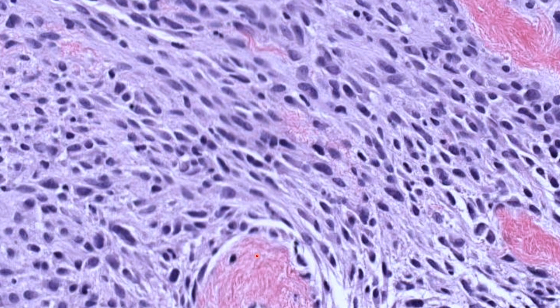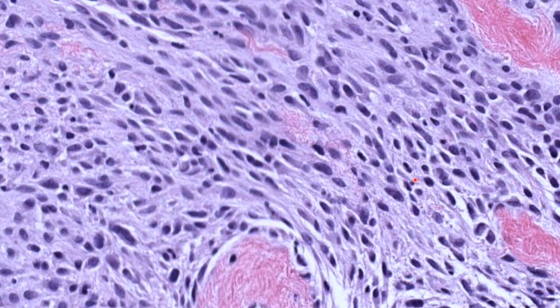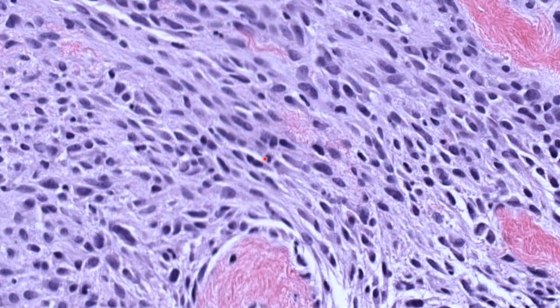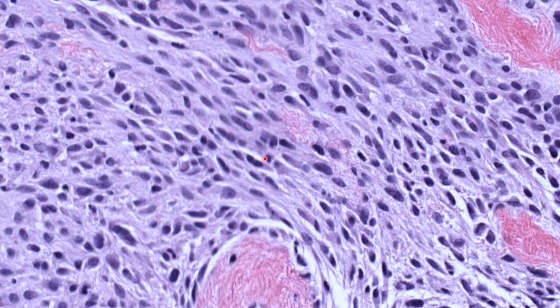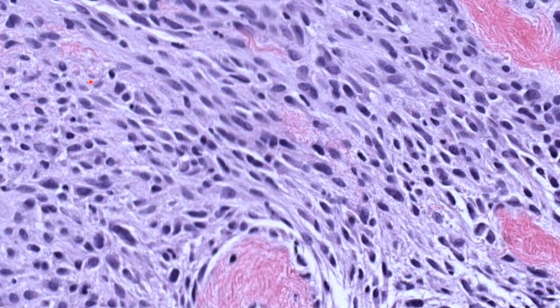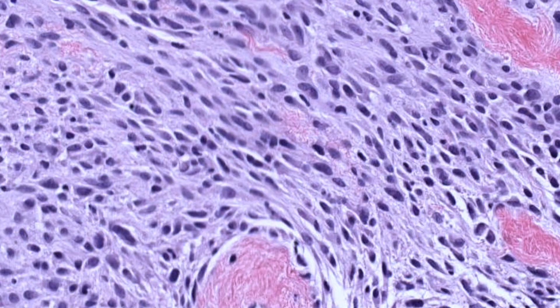Here is one more image from the same myofibroblastoma case but a different area. In the previous image the cell density was less; here there are lots of dense cells, so the entire field looks blue — amphophilic to basophilic cytoplasm — because every nuclei has a comet tailing of blue color. The cytoplasm also appears bluish because myofibroblasts are more active during regeneration, meaning more protein synthesis, more mRNA content. You can also see collagen fibers here as well.